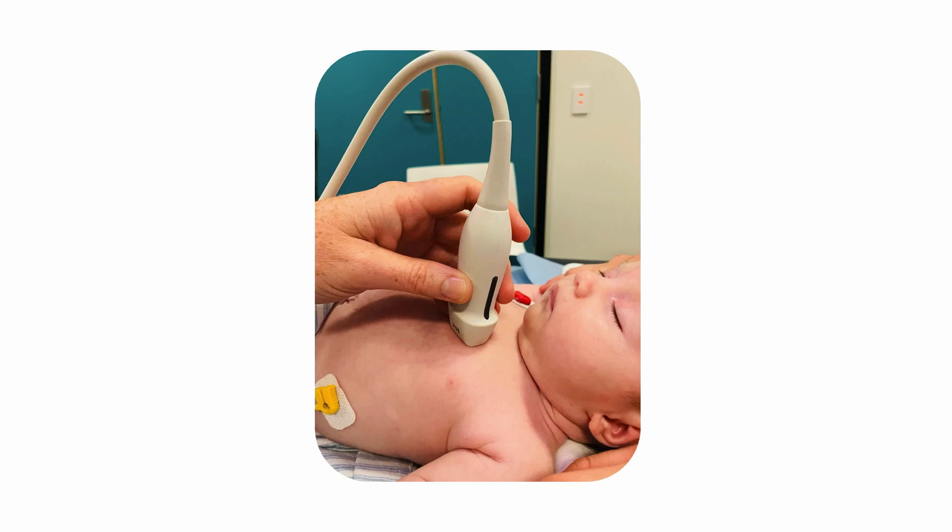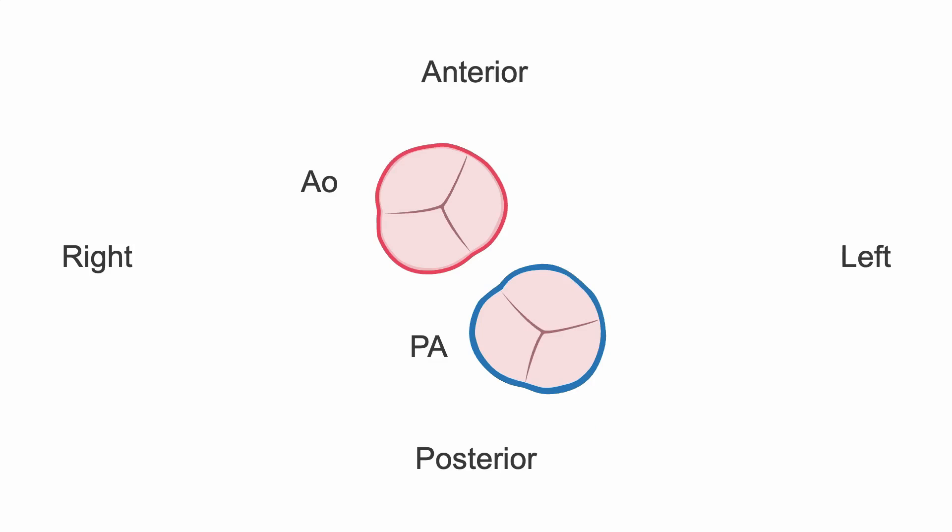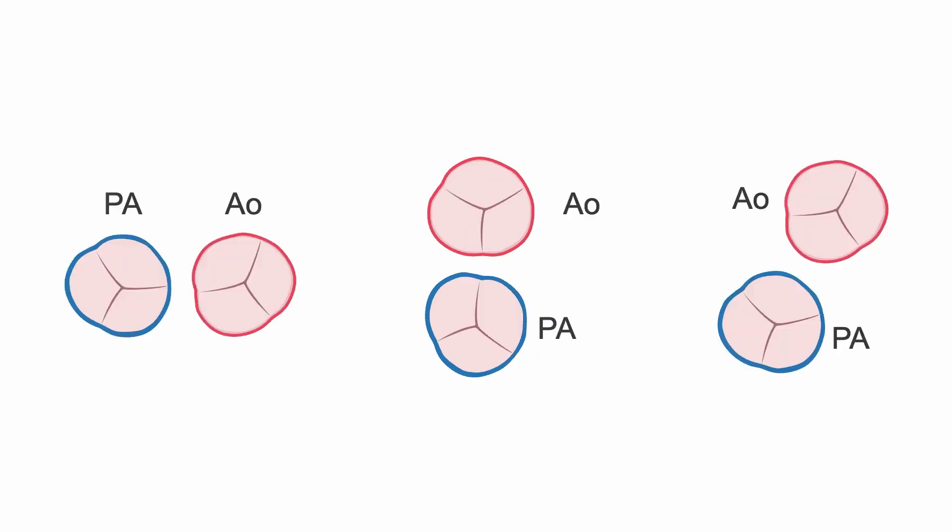Next, in the parasternal short axis view, take note of the position of the aorta in relation to the pulmonary artery. In TGA, the aorta is most commonly positioned anterior and rightward to the pulmonary artery, although any position of the great arteries may be seen.